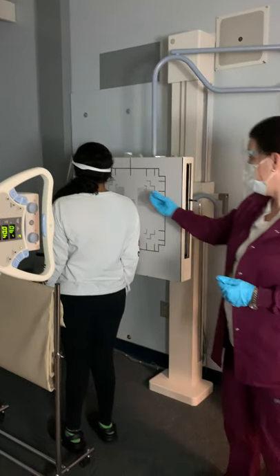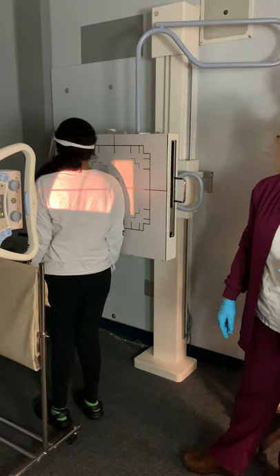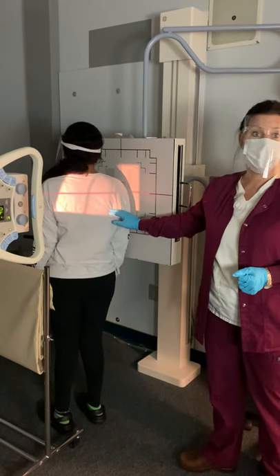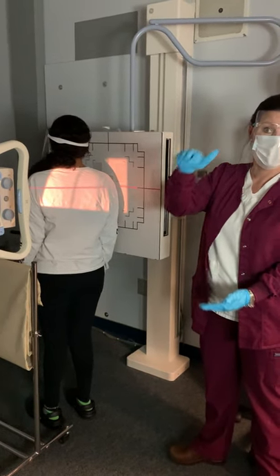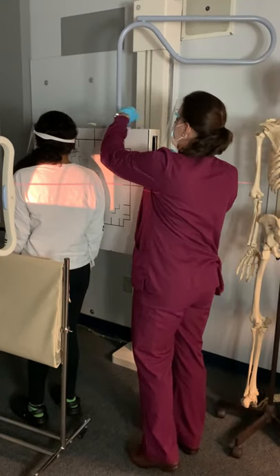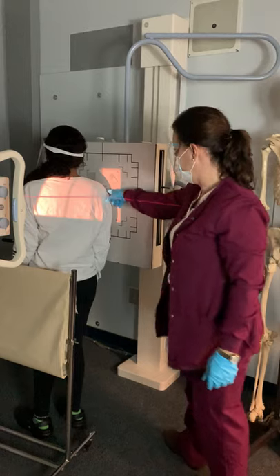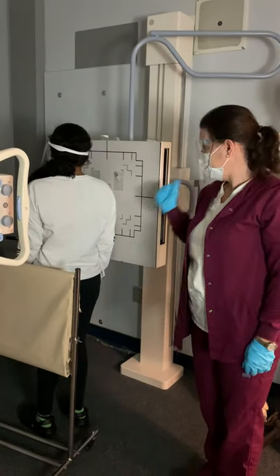What I'm trying to do is get the body of the scapula lateral, with the humeral head aligned between the superior angle of the scapula and the AC joint. Your humeral head should fall right in between the acromion and the coracoid process. Hold your breath — beep! Make sure you've got the inferior angle of the scapula included on this image — that's why we keep that 12 inches lengthwise. I have my patient shielded, I would mark this with the right marker, and I'm over my center chamber. Hold your breath — beep! You can breathe and relax.